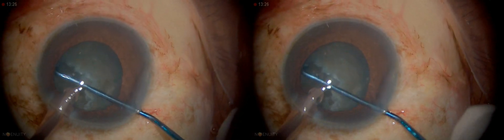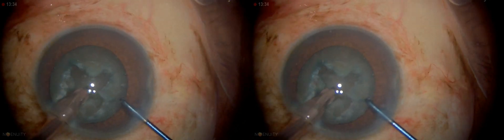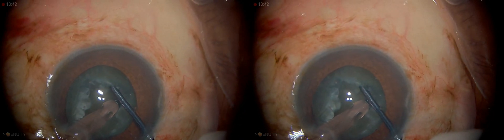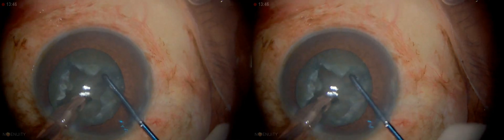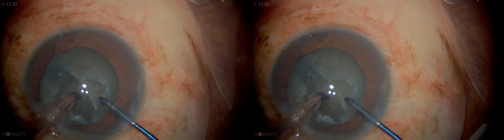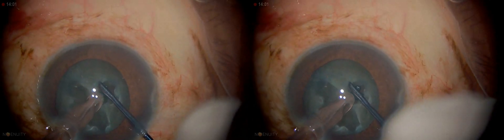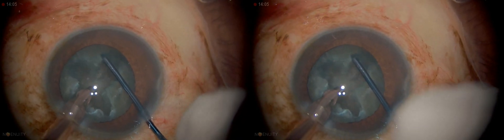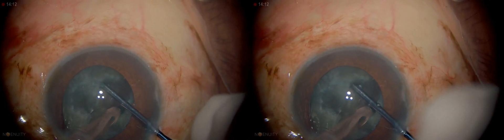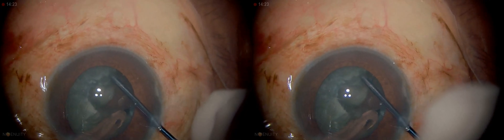I'm going to push this out and rotate. Usually when I do three, I like to see if I can crack — it saves time. It's cracked on that one. So we're going to rotate. If you have a good depth and good length, you can easily crack. These are all cracking very well. So now they've all cracked.